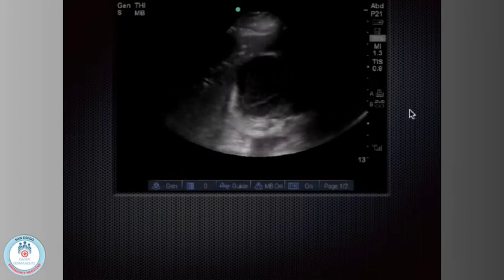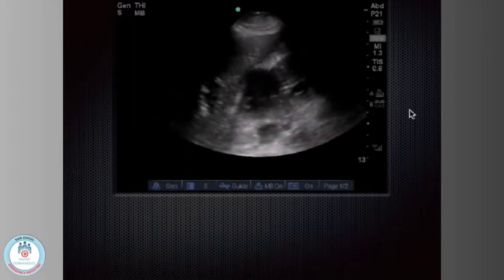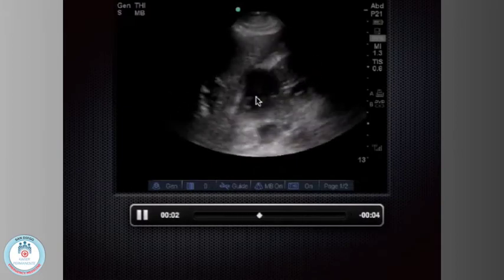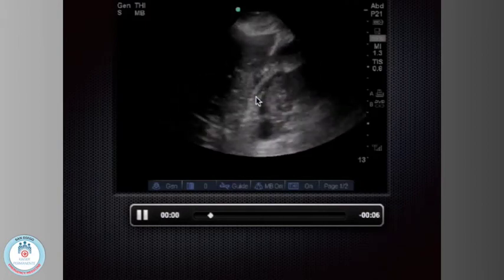Another kidney problem. Assist. What do you guys think? There's this. What is that? Is that like, it's not like an abscess? Yeah, that's an abscess. It's all pus sitting in that superior pole of that kidney.